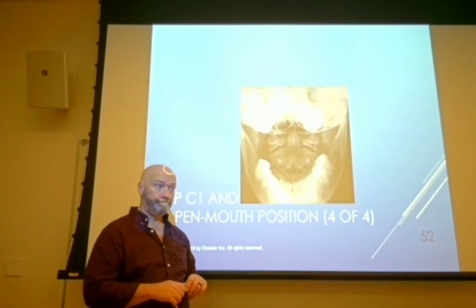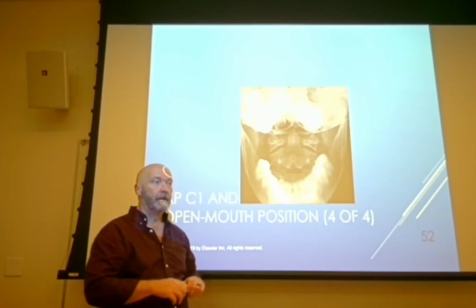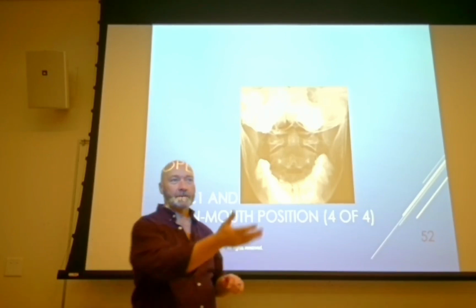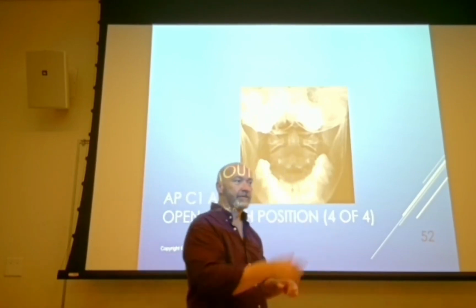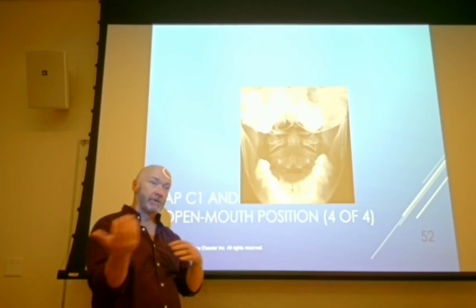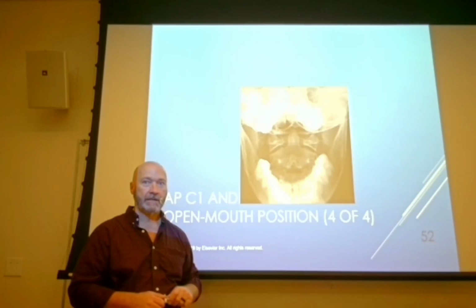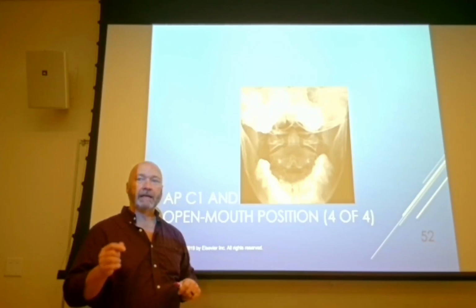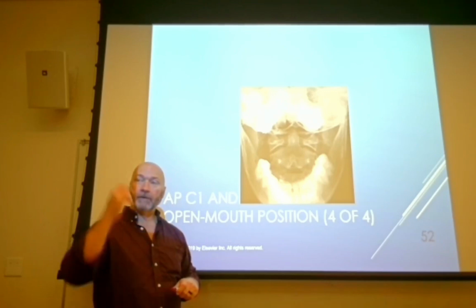Do like multiple, just stitch them together. Kind of like a tomogram or something. Yeah, but potentially. We actually used to do tomograms. We could do those of the odontoid process. But anytime you can't get the patient to move, what do you do? The tube. The tube, angle of central ray, right.